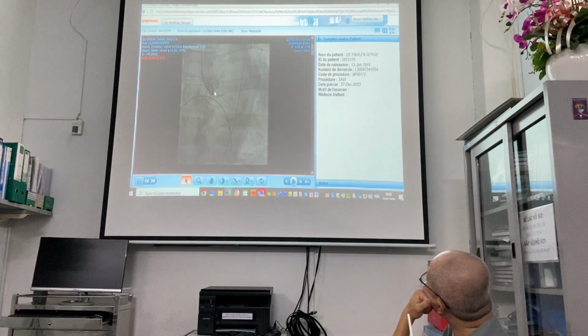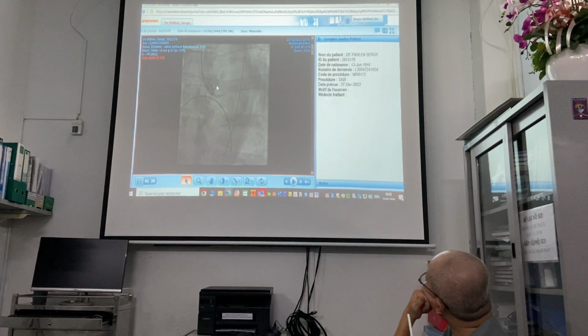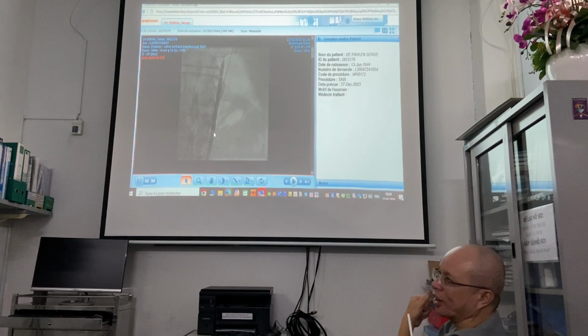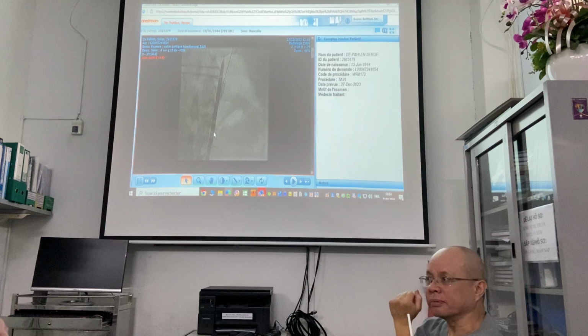There is a software that enables you to see the plane of the valve, so that you are parallel to the different cusps. You can see that over here. And we have two views. There is one view that is called the cusp overlap view, because we are going to implant this, the CoreValve, the Evolut from Medtronic, which is used in Vietnam.